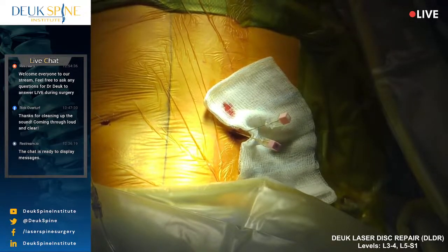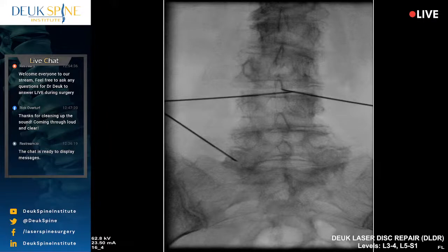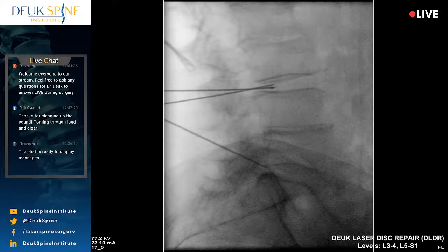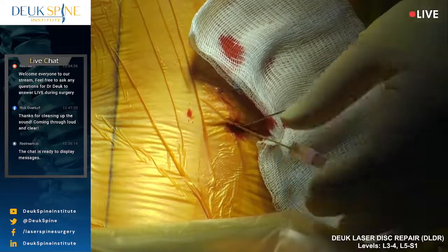Try to lay still. Shot. Give me an AP. Once again, we use two views, at least, AP and lateral. All right. Shot. Still pressure in the foot? Yeah. All right, we're almost done, I promise you. I've just got to get this one last part just right. Where do you feel it? All right. I'm going to come in a little bit lower than I was. See if we can make it a little better. Just relax, you're doing good.